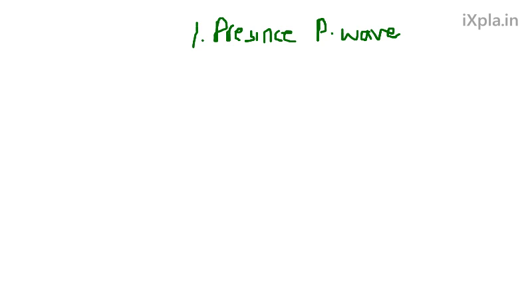If there's no P wave, that means the atria are not contracting. It's the ventricles. We'll go over all the ventricular arrhythmias later. Those are the really exciting ones that are fun to learn about. Also very dangerous, but exciting. And those don't have a P wave because they originate within the ventricles.